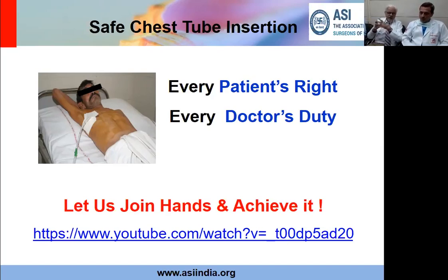One question has come up, and you also touched upon this aspect in your presentation, that was pleurodesis. So that's related to intercostal drainage as a bridge to pleurodesis in certain patients. I believe that most of the time it's thoracoscopic, but in some situations in the beginning you do intercostal drainage, and subsequently you go for pleurodesis. What is your regimen? So pleurodesis, what you use and what regimen, depends on the cause. Let's say malignant pleural effusion is one cause where we do it.